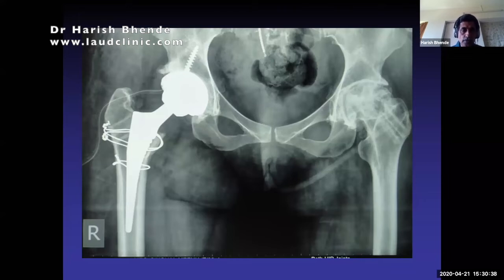I have tried to remove a Corail 8 weeks after the primary surgery. It was extremely difficult because bone ingrowth becomes quite rapid. So this becomes like an internal biological plate, and this calcar heals very well, and this patient in the long run had no problem. But it is very important to notice these things, and this happens.